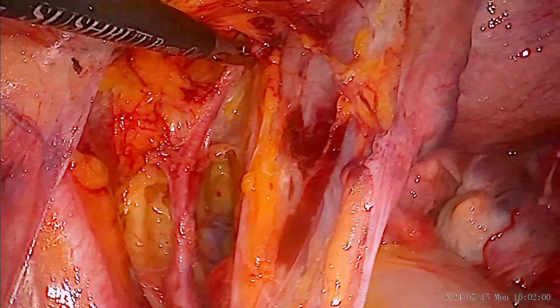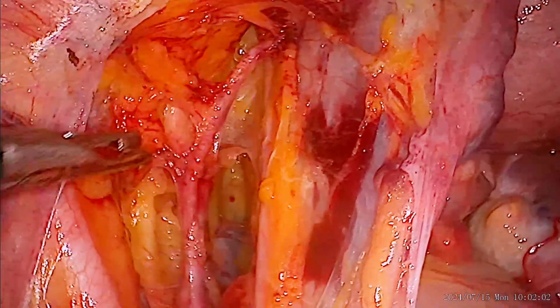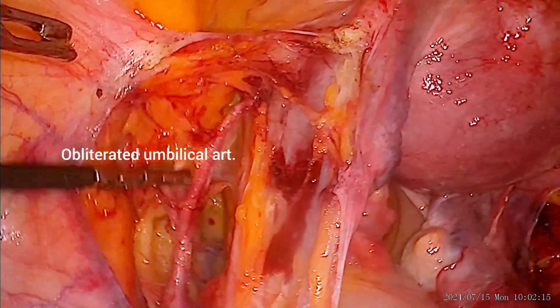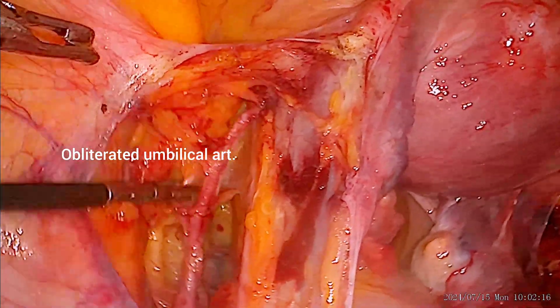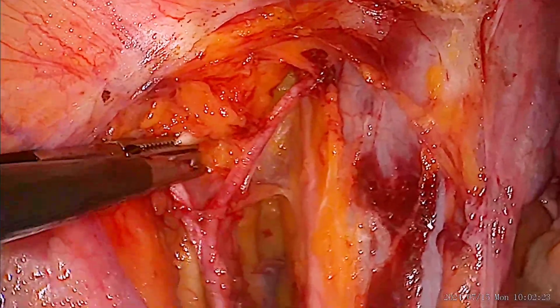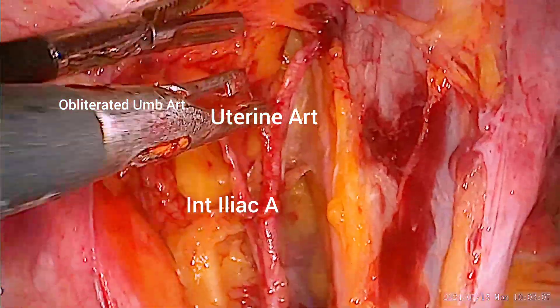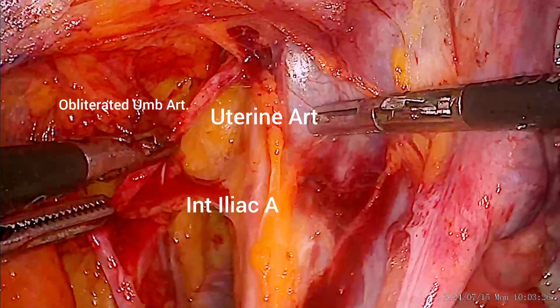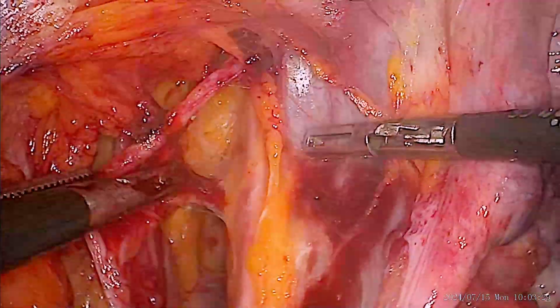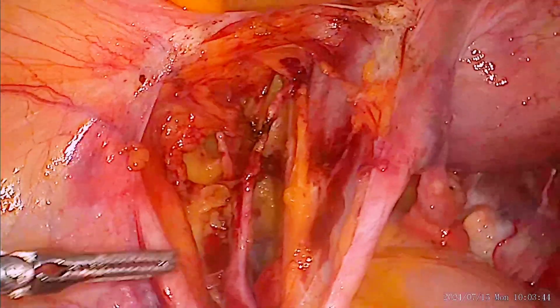You can see all the vascular structures clearly. Here I am dissecting the obliterated umbilical artery. If you tug on it, you will see that the uterine artery is also moving, and the internal iliac artery also moves. This is the uterine artery at its origin.